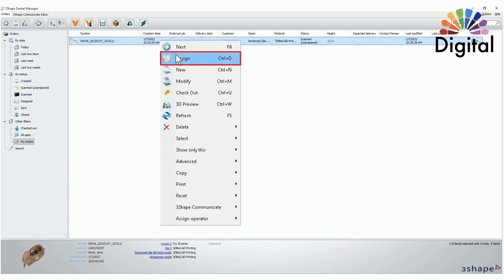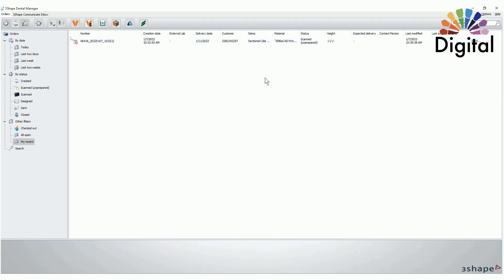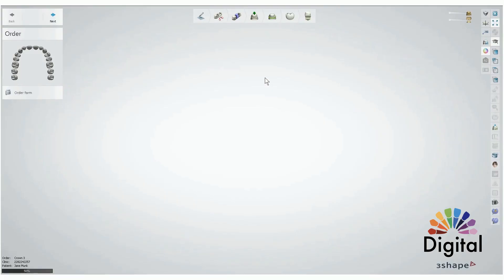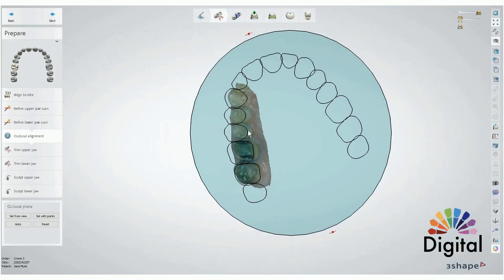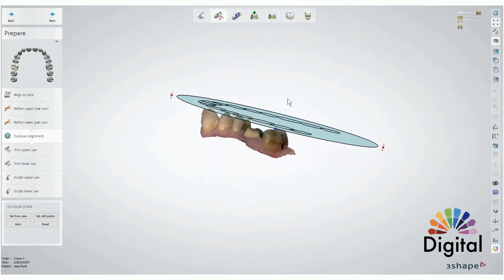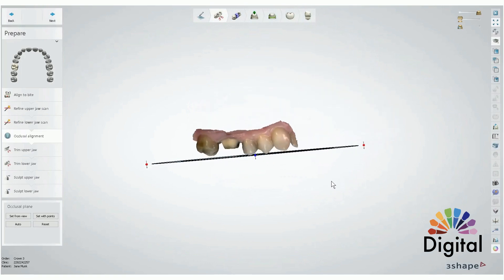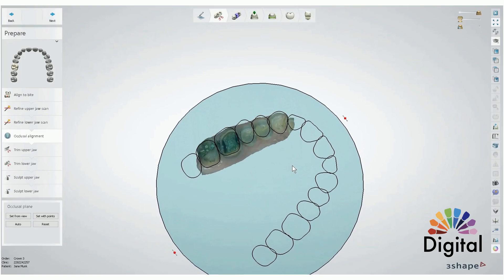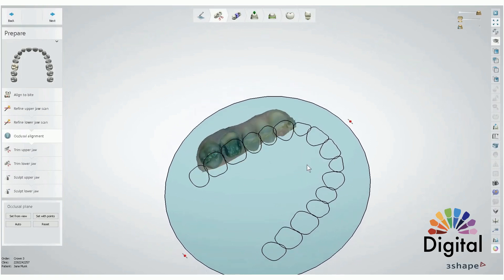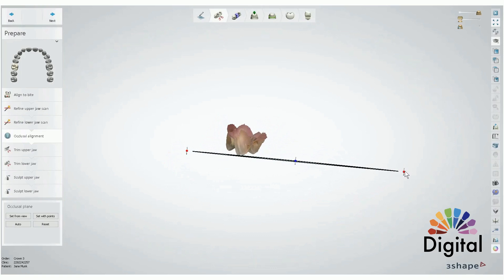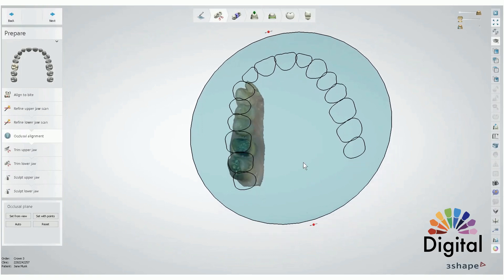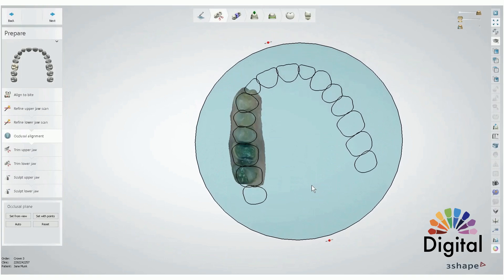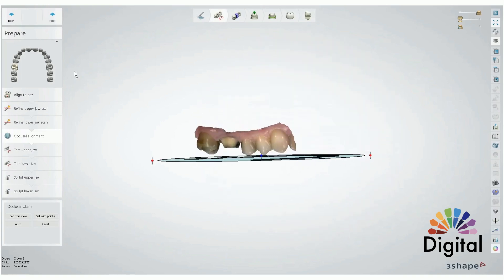Once we get into design, we always start with the prepare step first. Zoom out a little bit and make sure the occlusion plane matches well to our scan. It doesn't need to be exactly the same match, but this plane will help to use the virtual articulator and also the model base in the model builder too. Once it's good, we can go next.